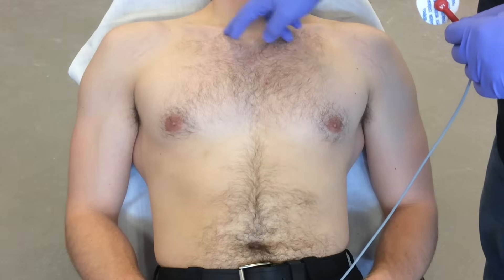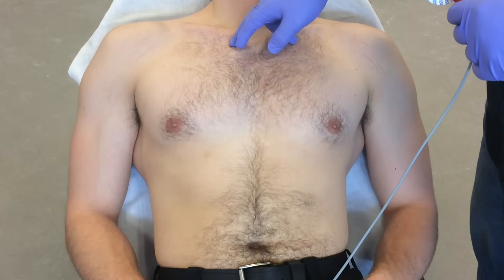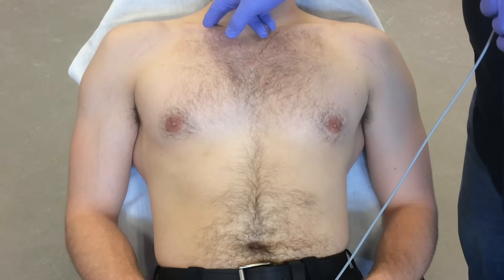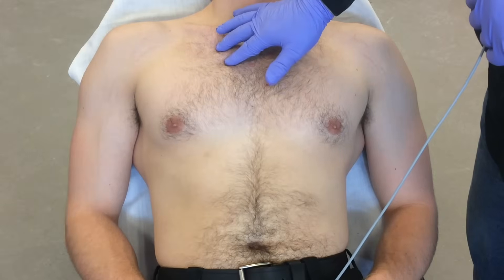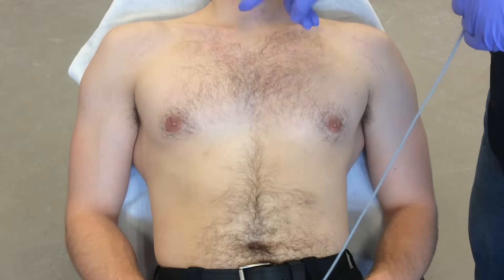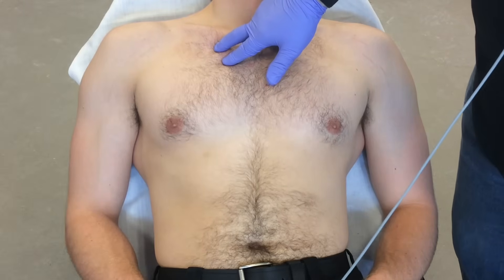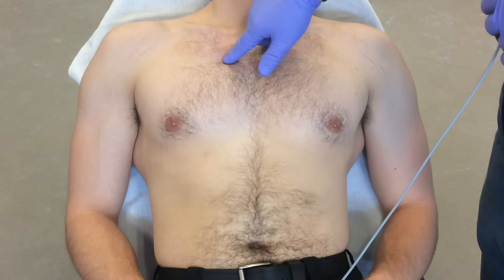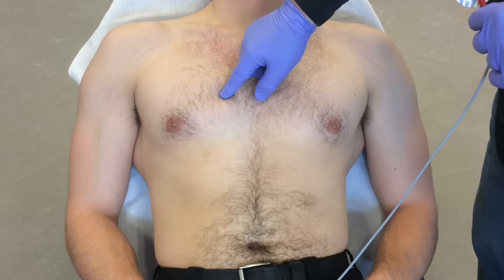The clavicle rests here and the first rib comes off of the manubrium right below the clavicle, but then it takes a hairpin turn up and around sort of underneath the clavicle. When you palpate just below the clavicle using the surface of the tips of your fingers, the very first rib you're going to straddle is the second rib. So the space below it is the second intercostal space, then the third, and the fourth intercostal space is right there.